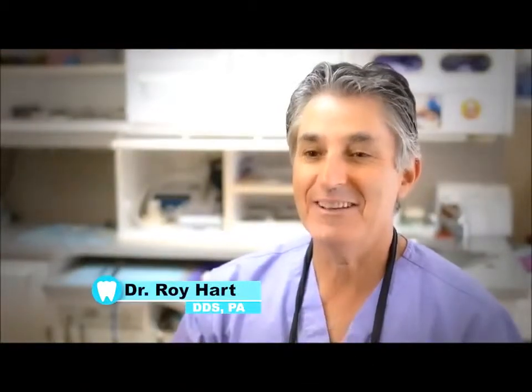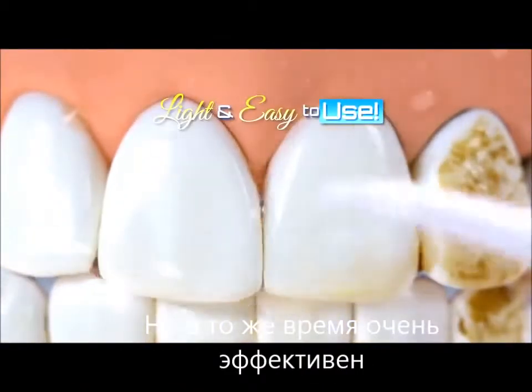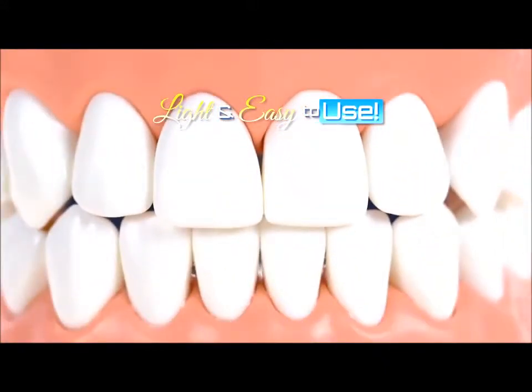The most important thing about flossing is actually doing it. The Power Floss is amazing — it's very light, very easy to use. You just put the water in the reservoir and pump away.